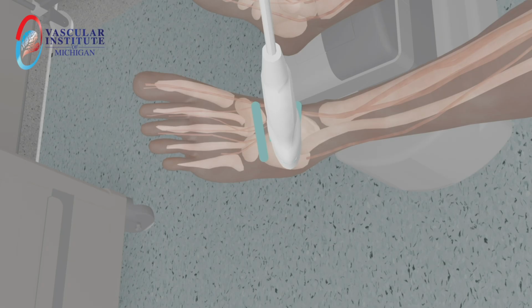The Dorsalis Pedis Artery is accessed via ultrasound guidance using a micropuncture needle. Once the blood return is noted, a micro wire is advanced through the needle into the Dorsalis Pedis Artery. The needle is exchanged for a transitional sheath, which is advanced over the micro wire.